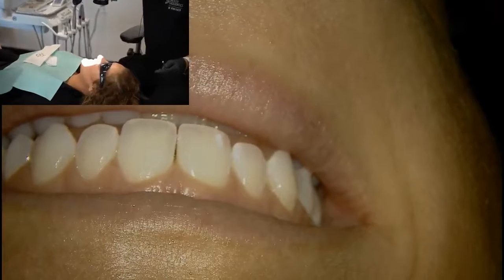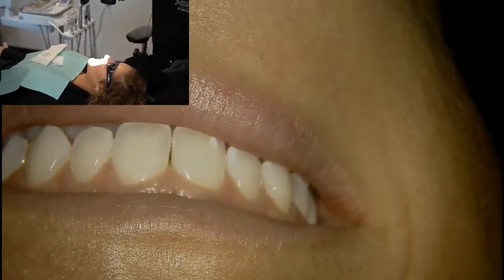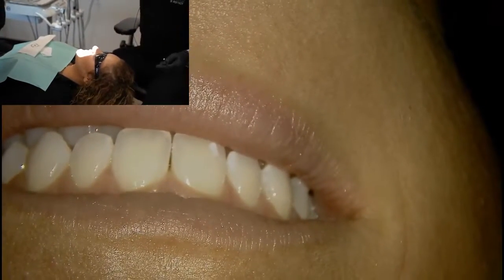And I'm on now full power here. So just little things to think about. And that's true with any light, right? That's not different than with the LED lights you use on your loops. So you could do a loop, a video hybrid if you wanted a scope just for video documentation.